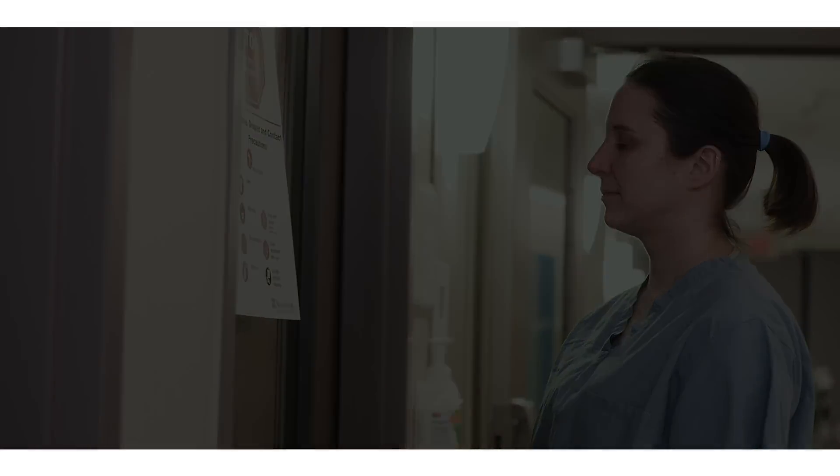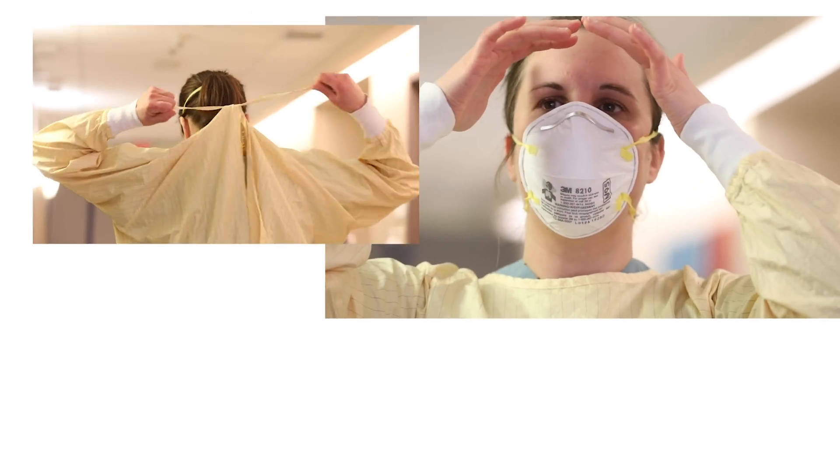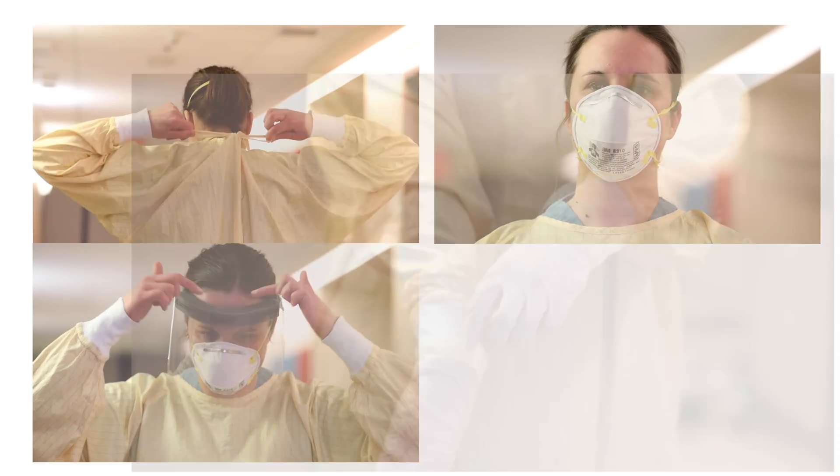These require you to wear the following personal protective equipment: gown, fit-tested and seal-checked N95 respirator, face shield, and gloves.